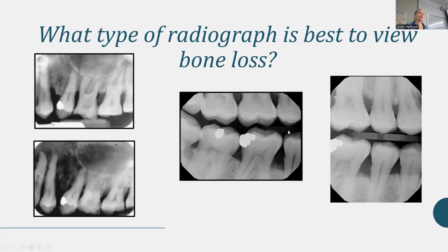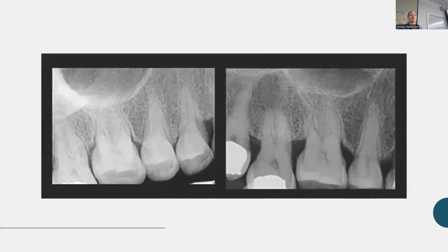But that's just such a perfect example. And it happens, it just happens. We get busy, we get kind of overwhelmed by this new patient experience. But that's what we want to try and remember. And here's just another example. We get foreshortening and elongation, and it's just such a clear example of how the bone level gets distorted when we're angled.